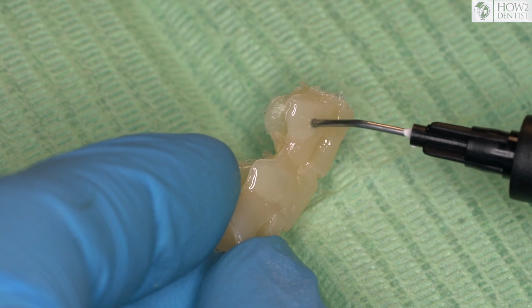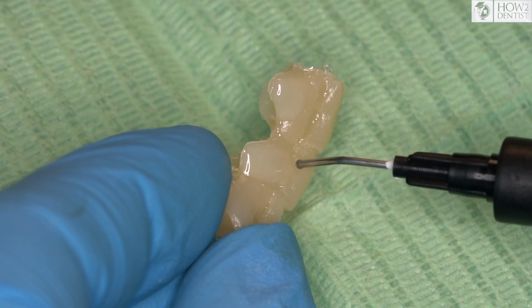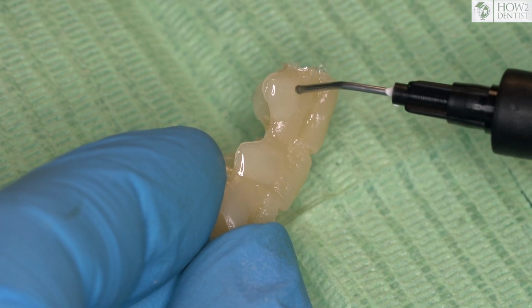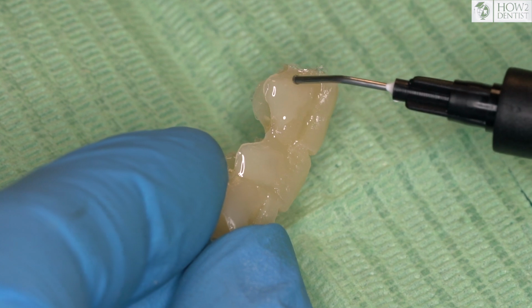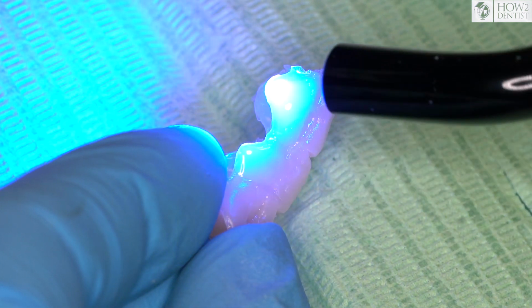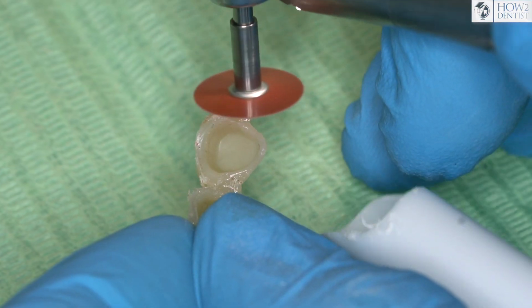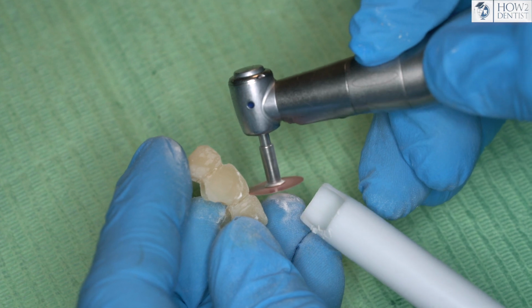The just polymerized chemical curing composite can be safely, without fear of delamination, corrected by the light curing composite to give the desired shape. We explained the chemistry of the process in previous videos, from which it is clear why the long-standing composite is not so easy to bond with a new one. Finishing the restoration, and for a fairly short time, the patient is conditionally rehabilitated aesthetically.